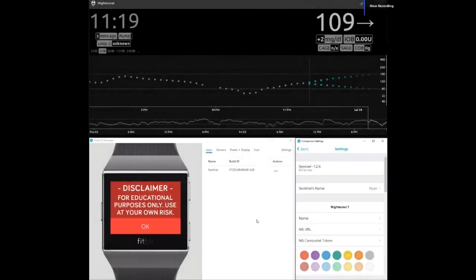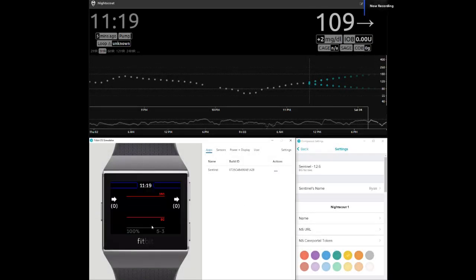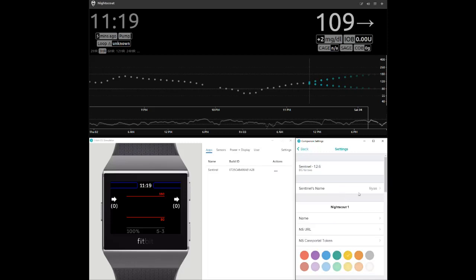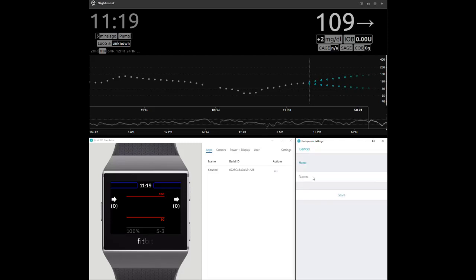This is a brief overview of the Sentinel Clockface for the Fitbit Ionic and Versa watches. Using the Fitbit simulator, this video will demonstrate how to enter the correct values into the settings, so that users will be able to monitor two NightScout accounts and submit care portal entries.